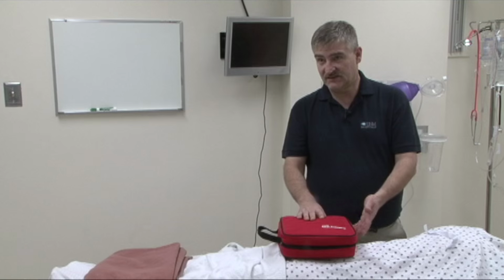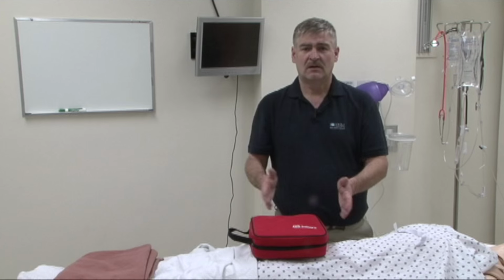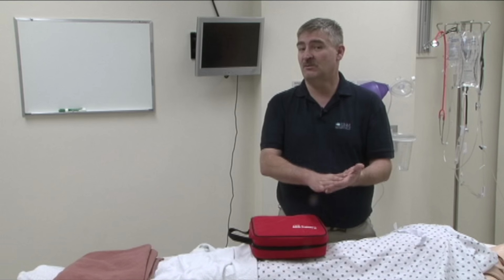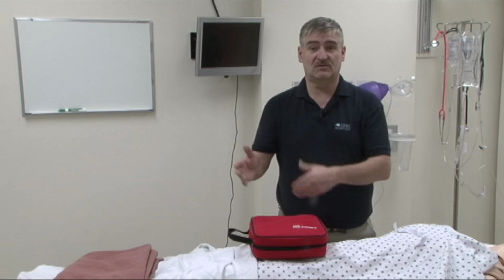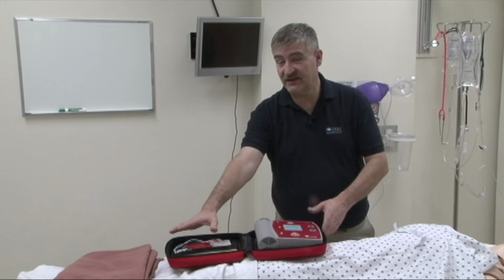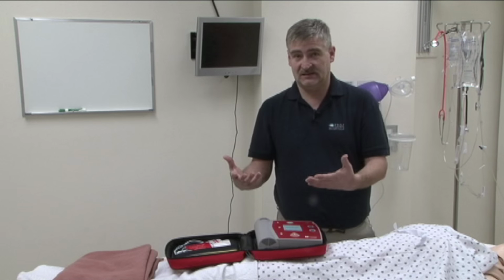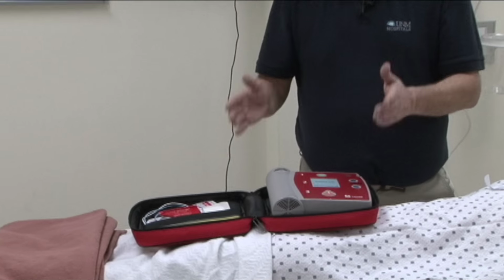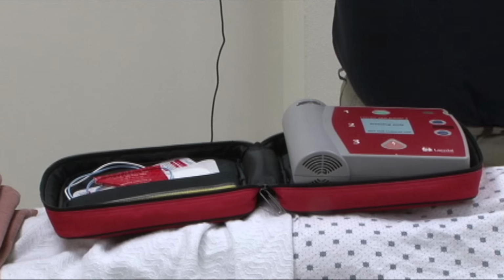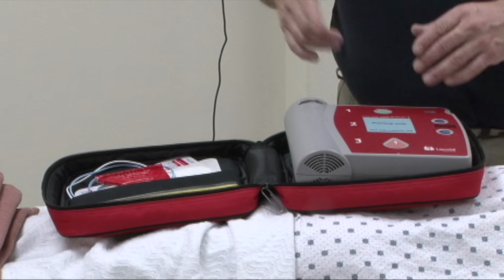Okay, so this is an AED, Automated External Defibrillator. This defibrillator is non-specific. This one is a product of Laerdal, but there are several AEDs out there. Some have an LED screen, some don't, some you just put on the pads and you use it. You open it up and usually you'll have steps exactly how to use it. They will talk to you. It has a sound device, so once you turn it on, it will say whatever you need to do next. They've done studies with 6th graders, and 6th graders are actually able to use these devices without any problems. It tells you exactly what to do.